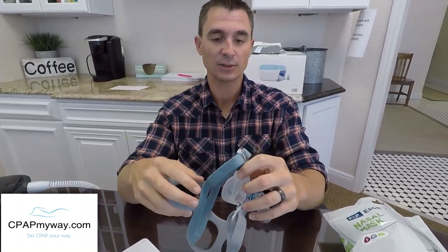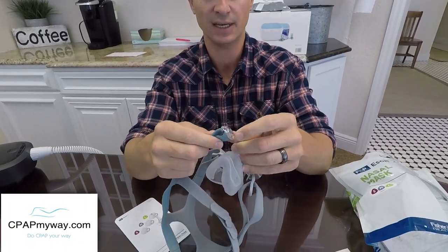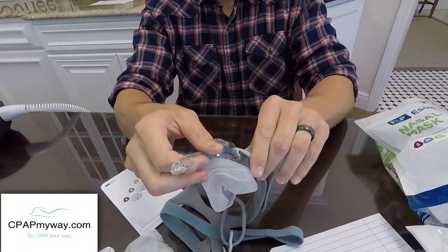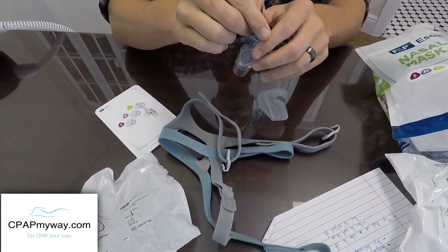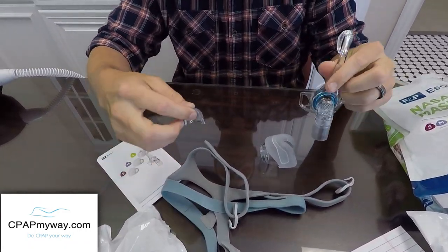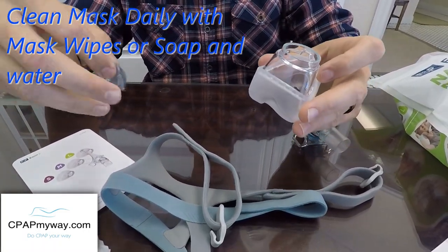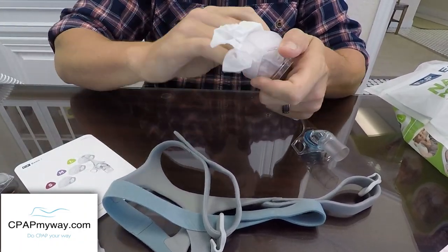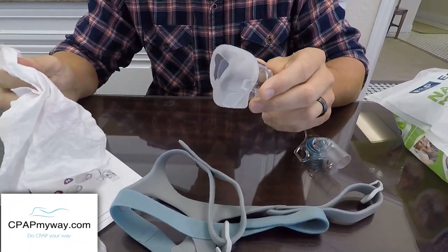As far as maintenance goes, which we alluded to earlier, it's really simple. You've just got a few pieces to the mask, right? Your headgear slides right out of the little loops there, and you've got the bottom straps that come loose. So you've got your headgear, your seal, and your frame. And then additionally, just keep track of this little diffuser. As far as the maintenance schedule, you need to clean this part daily. We recommend mask wipes, so you can literally just snag a mask wipe, clean it inside, clean it outside, and you've done your maintenance for the day.